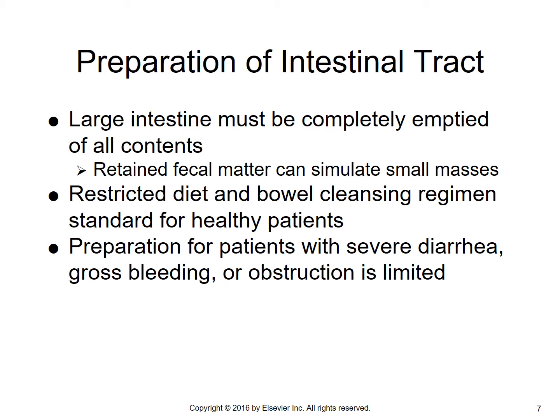That means that the patient is going to follow a very restricted diet. Usually the day before the exam, it's clear liquids only, no dairy that could produce any gas. And then there is a bowel cleansing regimen that the patients would follow the morning of the exam. They're going to do cleansing enemas on themselves, perhaps what's called a Fleet enema would be used. It's generally a kit that's bought at the drugstore that the patient is going to follow to prepare themselves for the lower GI exam.